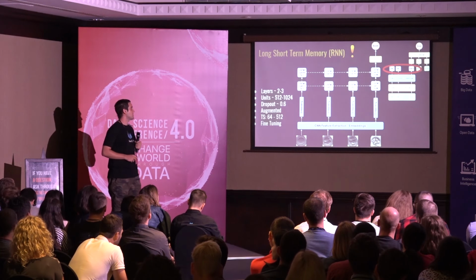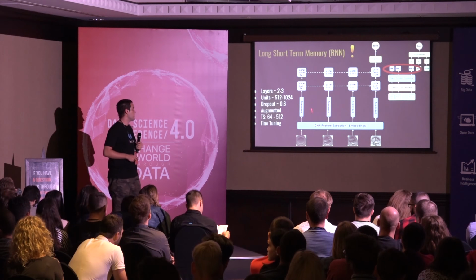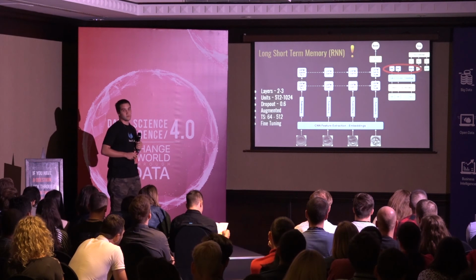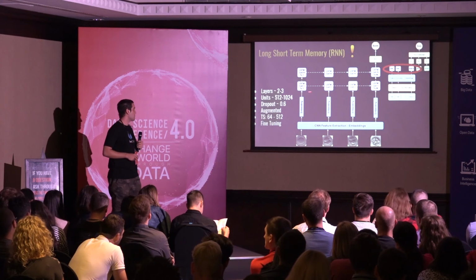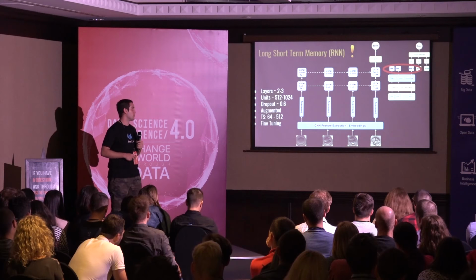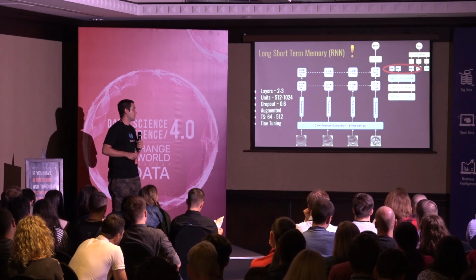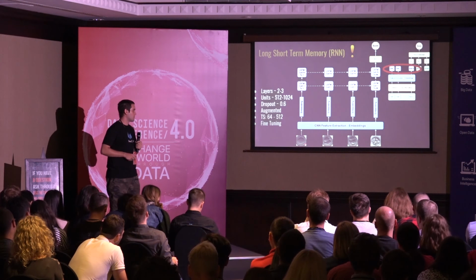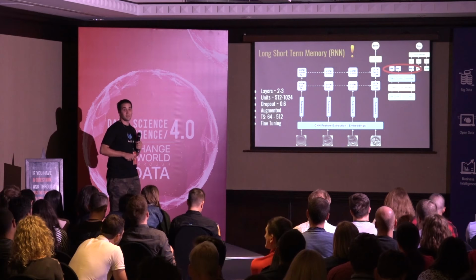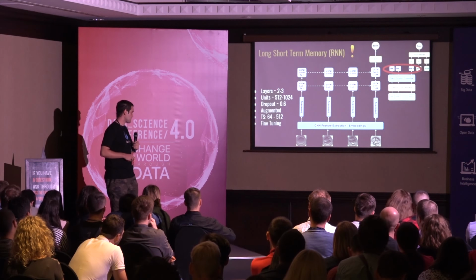So we used basically 2 to 3 layers, and in this LSTM about 500 to 1,000 units with some dropout. We augmented the data set both with image augmentation and with augmentation from downsampling. But image augmentation must be applied the same way to the whole video.